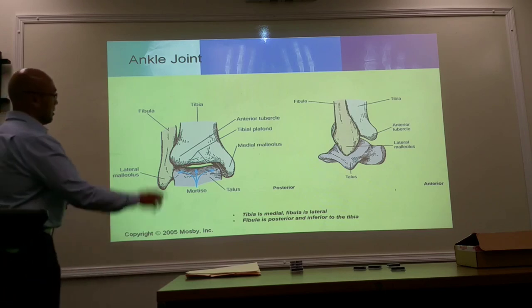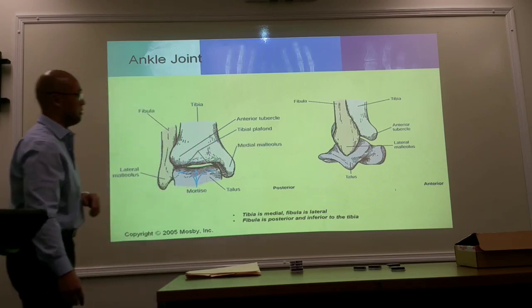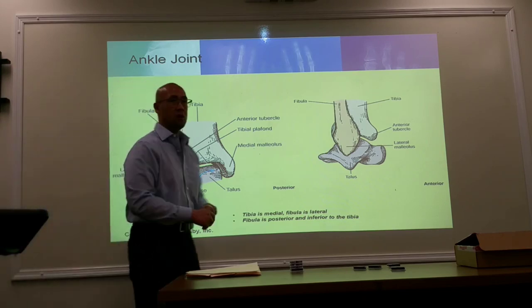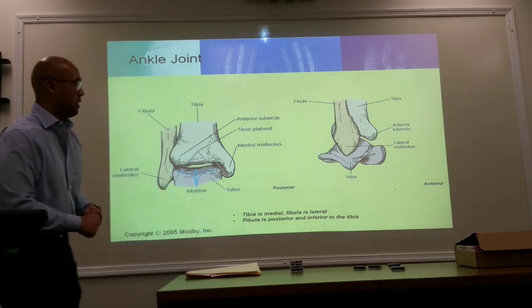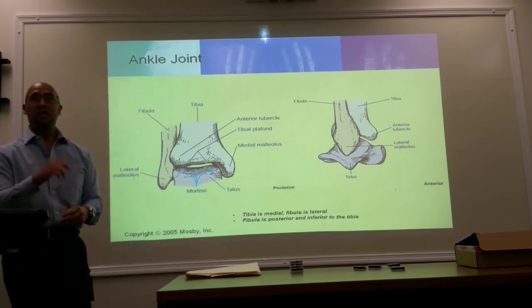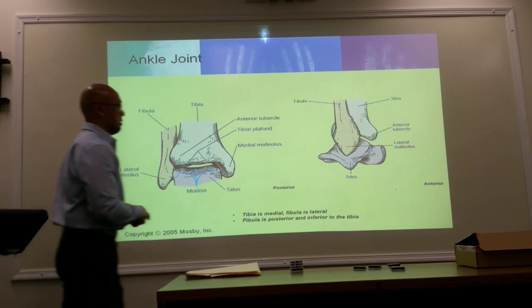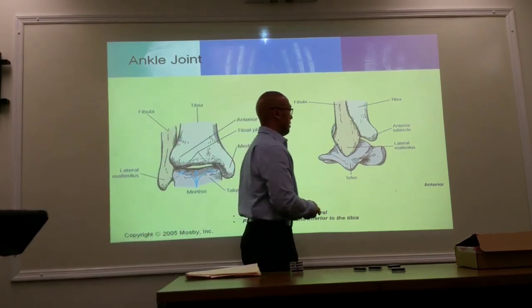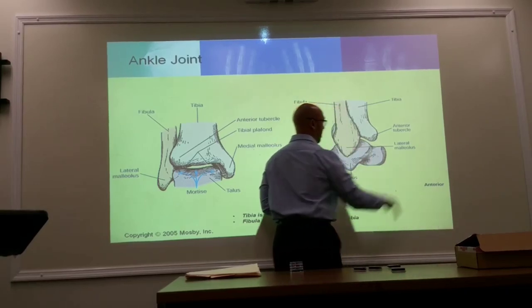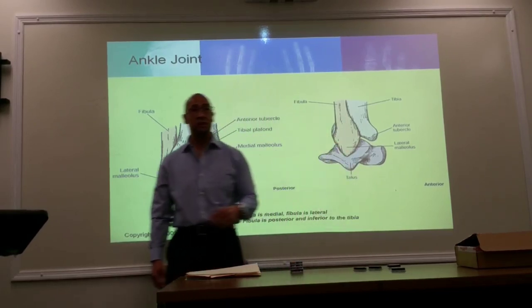Now notice over here, this is going to be your anterior view and this is going to be your lateral view. All the things that I want you to make note of is that when you're looking at the ankle laterally, the fibula is going to be more posterior and projects inferior when compared to the tibia. So this is the lateral. Anterior, your toes are pointing out this way. Your fibula is going to be projected lower and more posterior to the tibia.